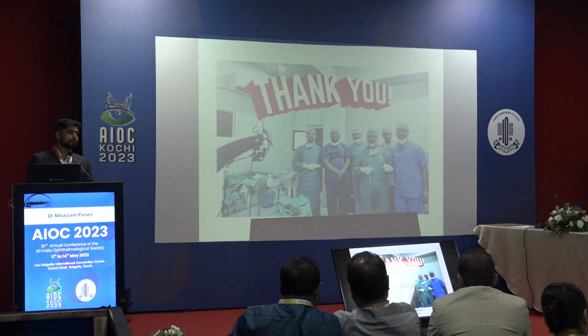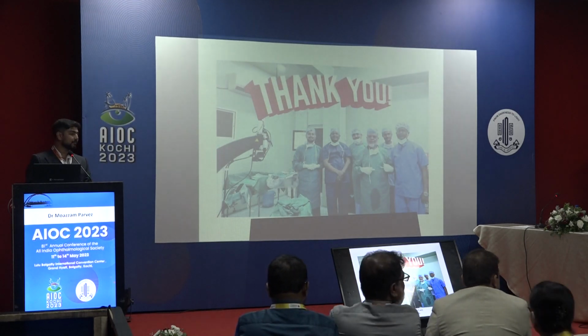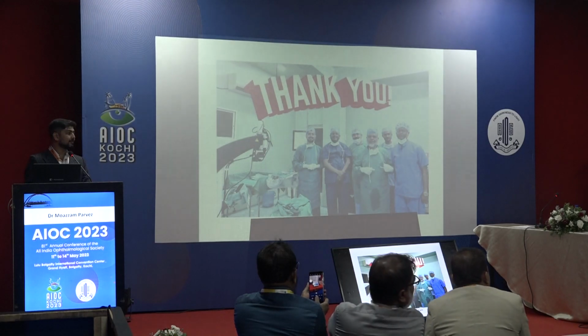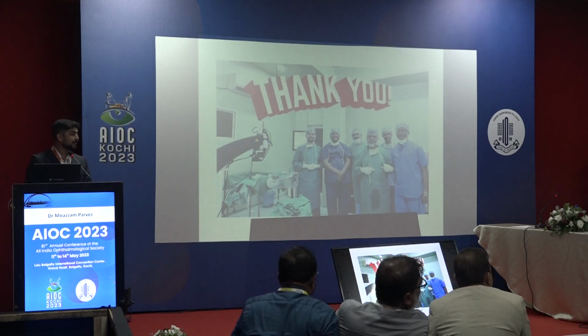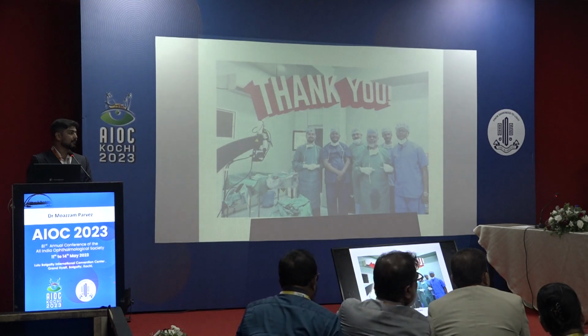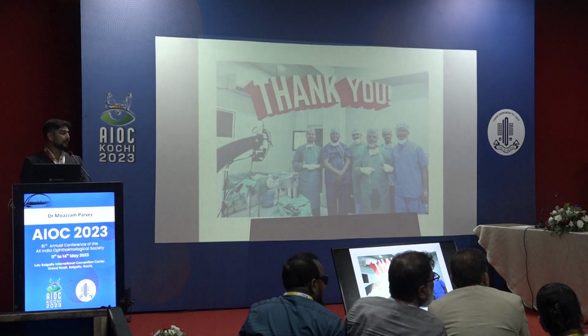Dr. Shah, any input for the junior surgeon here? Parvez is working very hard in Calcutta. Any input? Well, the last part which I would like to emphasize is that I often try to use a Healon-like substance while introducing the lens rather than methyl cellulose. The reason is it's easy to remove, number one.